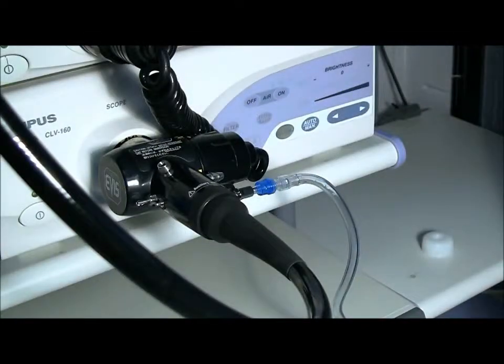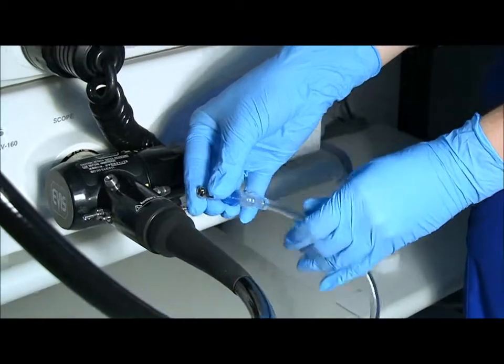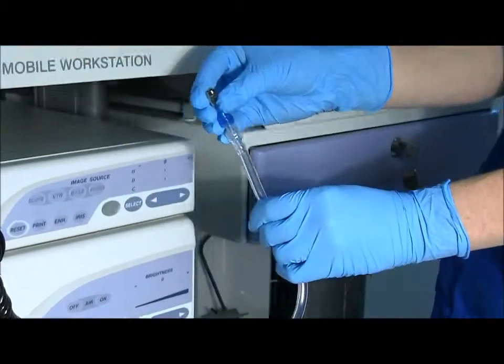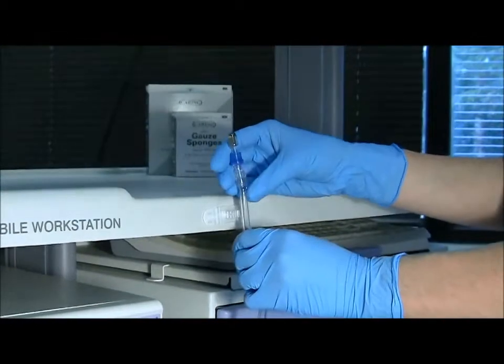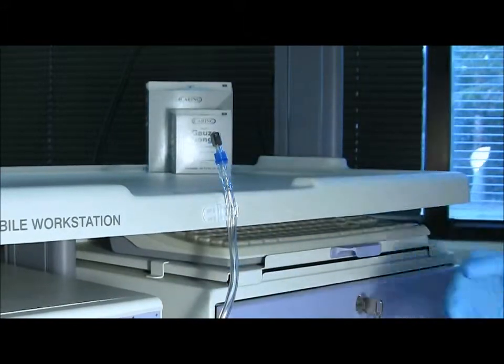After the case has ended, take the endogator tubing and connector and disconnect it from the scope maintaining a clean distal tip. Then place the tubing on the tube connector stuck to the trolley. When you are ready for your next case, simply reverse the steps.